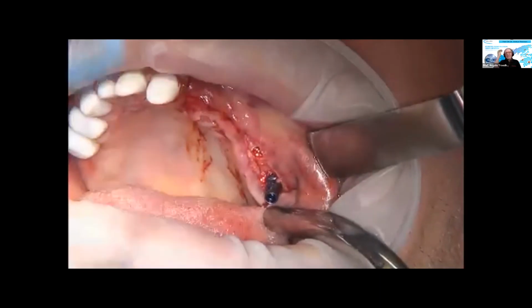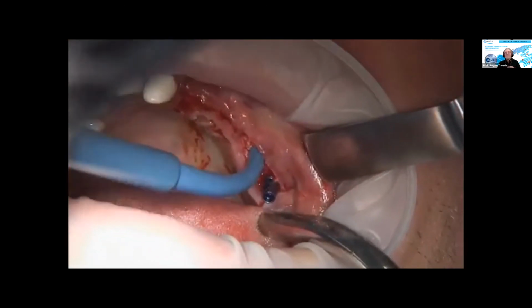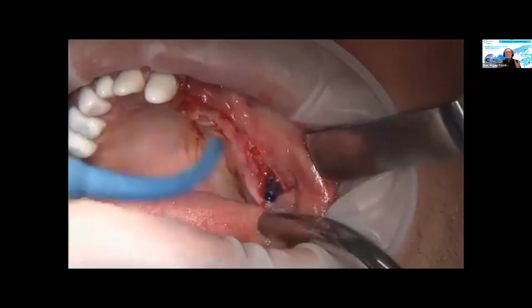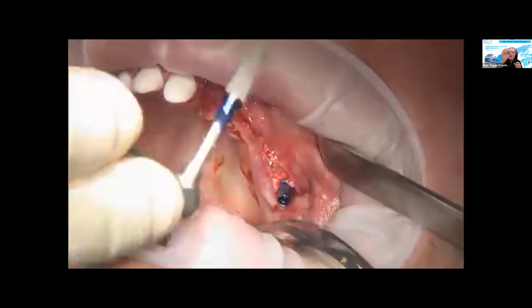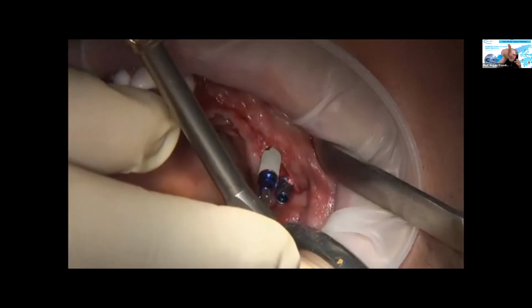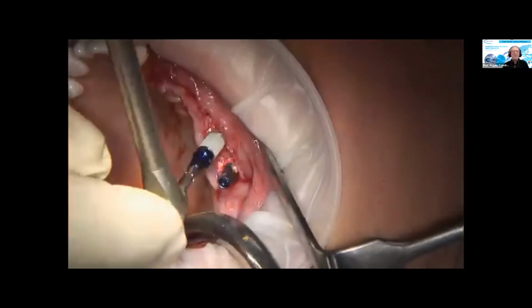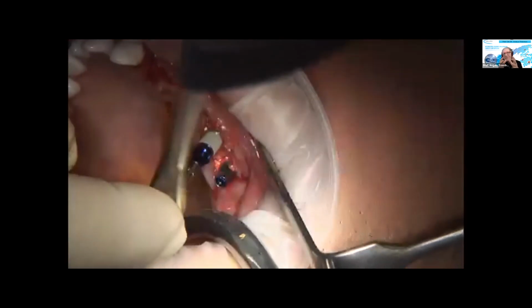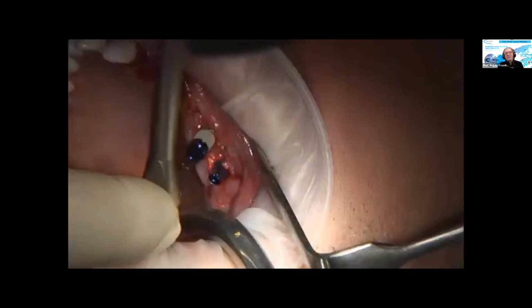Sometimes doctors, especially with the first generation of piezotomes, always said to me, oh, but it's so slow. But nobody tells you, or there is no evidence that fast surgery is the better surgery. Precise surgery is the better surgery. And if it takes you 30 seconds longer, take the 30 seconds to open the sinus floor, the second transcrestal approach for the second implant with a diamond-coated tip, please. Then, of course, if you feel better, because technically and physically speaking, it's not necessary, you can apply some additional amount of bone graft and then insert the implant.